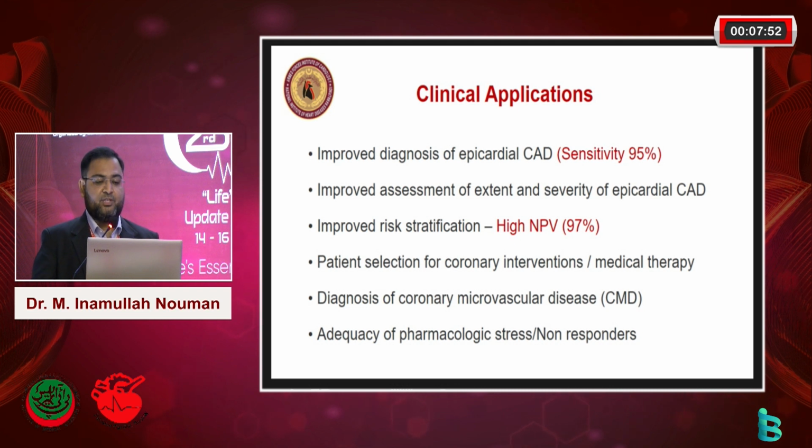Further, it improves the patient selection for coronary intervention and medical therapy. It also diagnoses coronary microvascular disease, and it confirms the effectiveness of pharmacological stress and identifies non-responders.